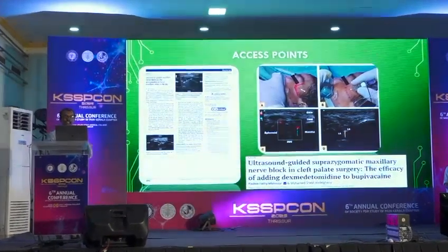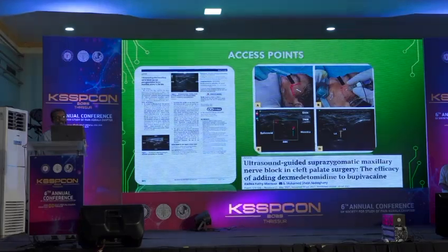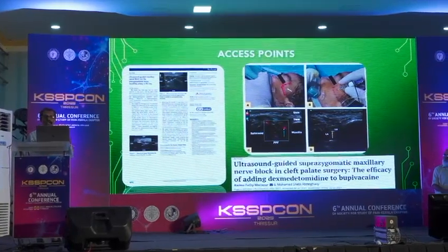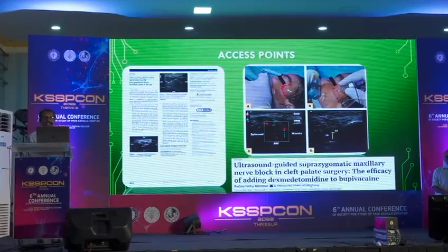So what are the access points? A lot of literature started coming in, particularly targeting ultrasound-guided interventions for V1, V2, and V3. But these are only terminal branch blocks, and there are a lot of difficulties in accessing these points. The first publication in 2013, Nader et al., actually targeted the pterygopalatine fossa.